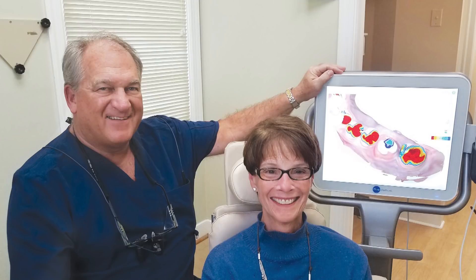Thanks to the durability of Bruxer Now zirconia, she can expect a long-lasting restoration without worry of fractures. In conclusion, since moving beyond traditional impressions over a decade ago, I have seen the efficiency, cost savings, accuracy, and convenience of digital dentistry transform my practice, increase profitability, and boost patient satisfaction.